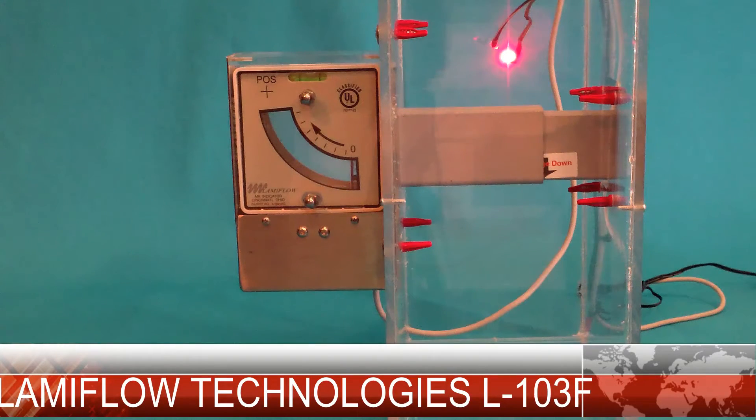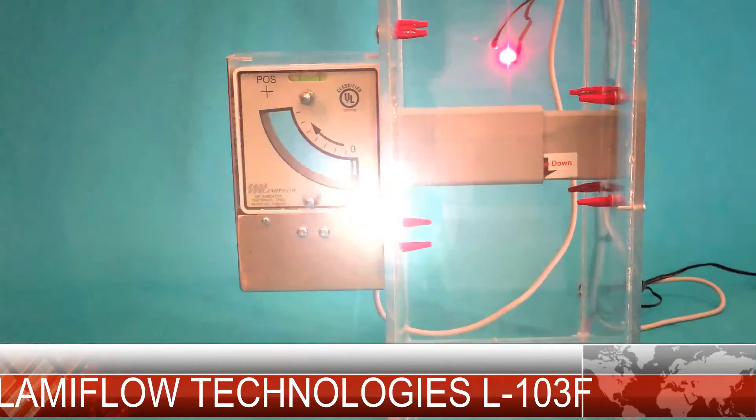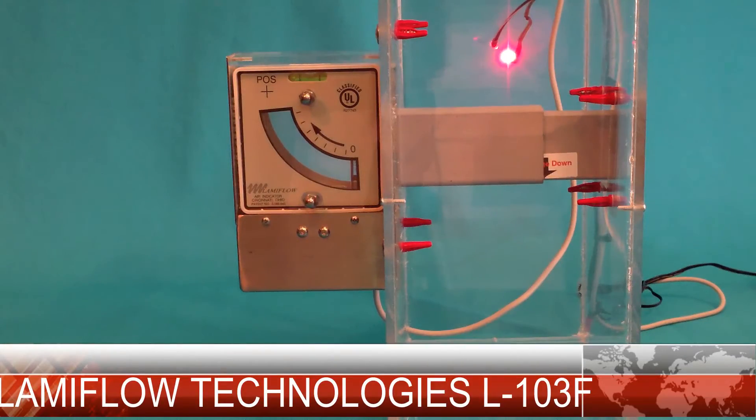Hello everyone. This is a video demonstration of the Lamiflo Technologies 103 series electronic airflow indicator. This unit is installed in a plexiglass box for visual reference. The LED lights are strictly for demonstration purposes and they do not come with the 103.